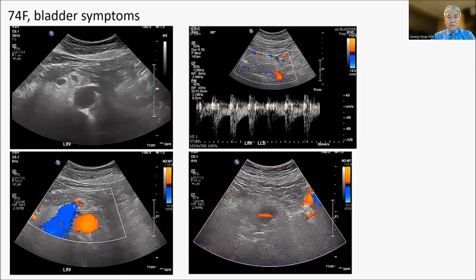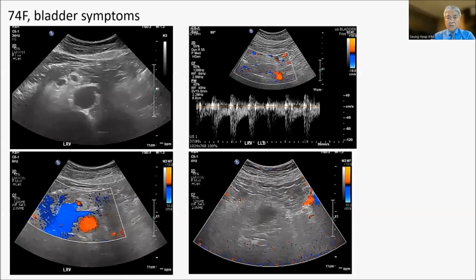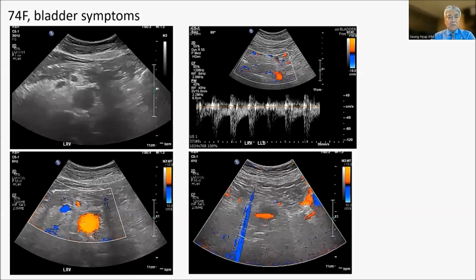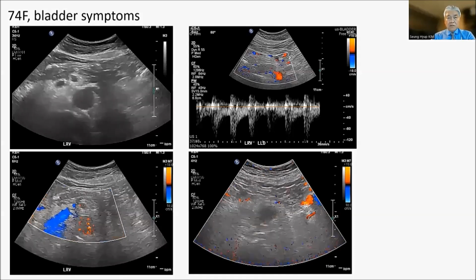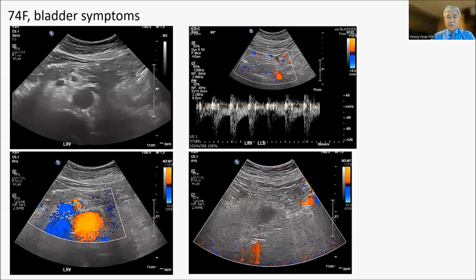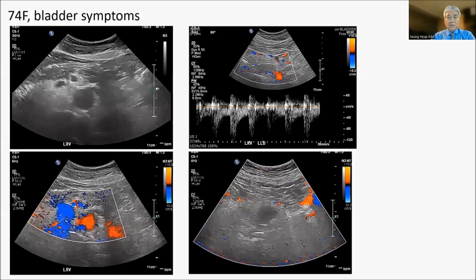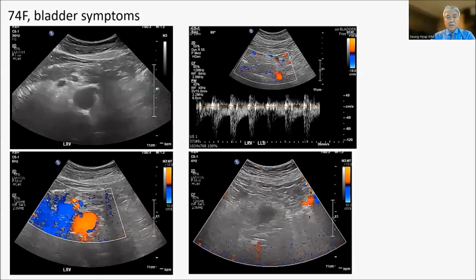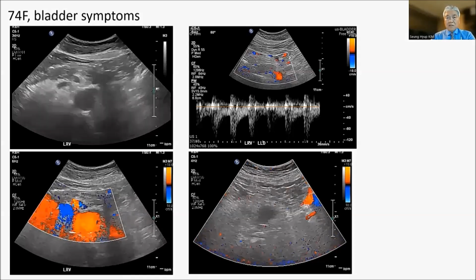When there are enough collaterals present, left renal vein is not dilated but is collapsed, and practically most of the left renal venous blood flows through the collaterals, and almost no flow is detected through the aortomesenteric left renal vein, and the flow signals are difficult to detect, while slow flows with low peak flow velocity are detected, like this case.